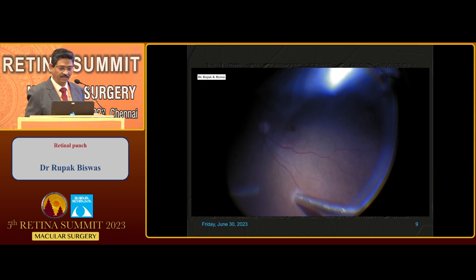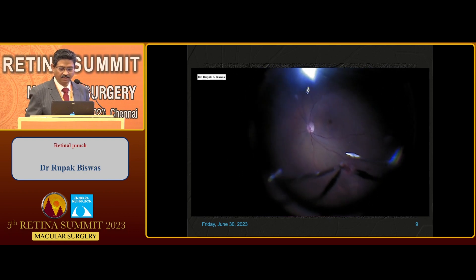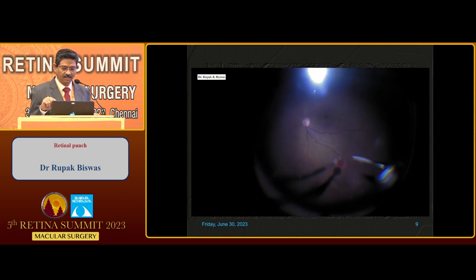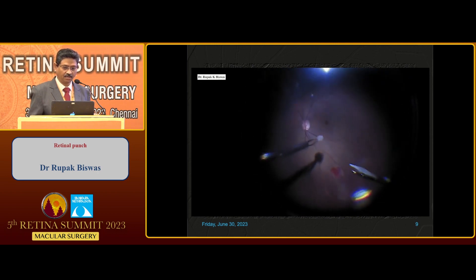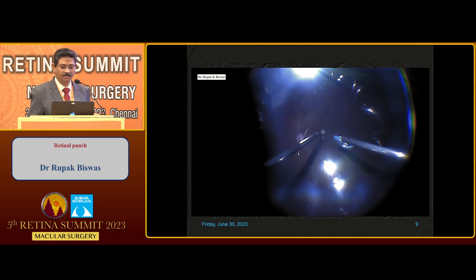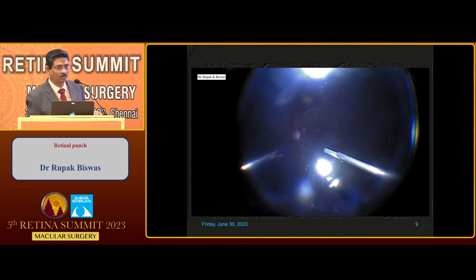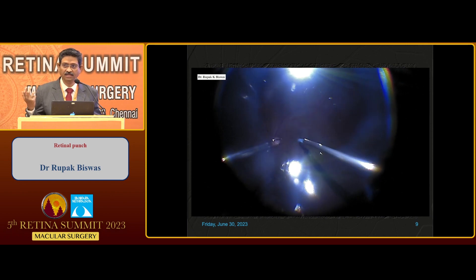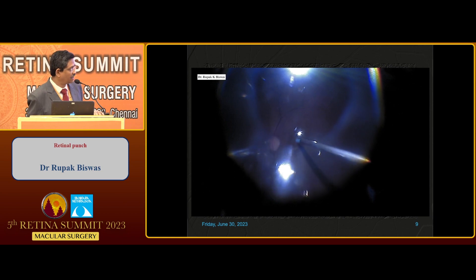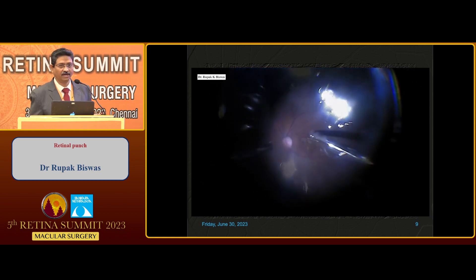Using the bimanual technique with Chandelier illumination, it is just a simple rotational movement. In the left hand, you hold the margin with forceps. The rest of the tissue you can take out with scissors. Then you do a fluid-air exchange and under air you just place it there. Then at the donor site, you apply laser and then tamponade.